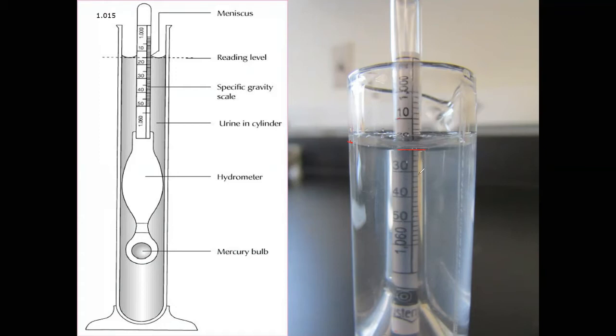And this particular hydrometer has lines every 2 thousandths. Okay, so 20, all right, and can't really see through the meniscus here, but we can count backwards. So 28, 26, 24, and this one here is 22. And so the reading on this, as I just said, is 1.022.